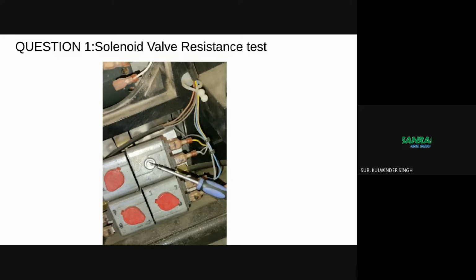So when the coil for that valve becomes energized, the tip of the screwdriver should be pulled down onto the valve stem.